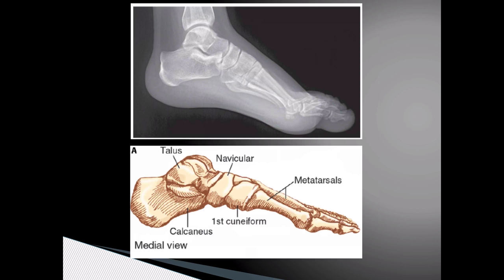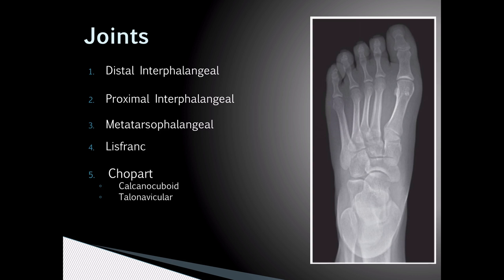Now we can compare the lateral view of the bony foot to its associated x-ray. Again, we see that the forefoot is made up of the metatarsals and phalanges. The midfoot is made up of the navicular bone, cuneiforms, and cuboid, which is not visualized on this film. And the hindfoot, which is made up of the talus and the calcaneus. In this view, you can see that the talus is a major component of the ankle joint.